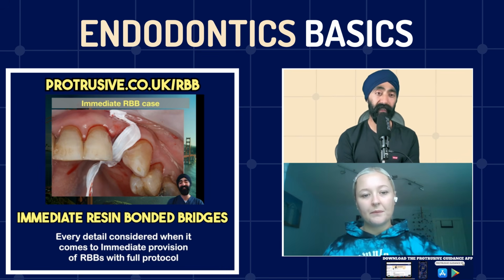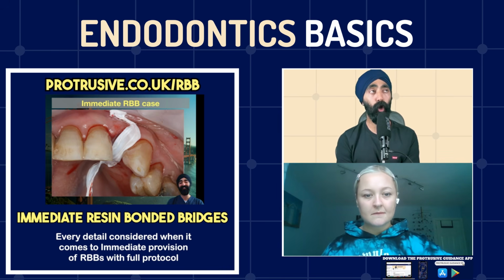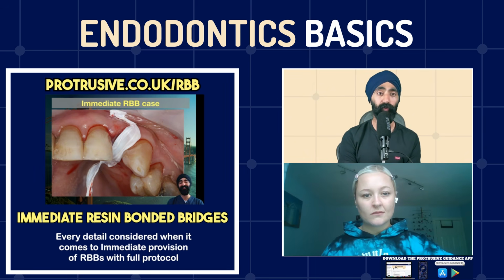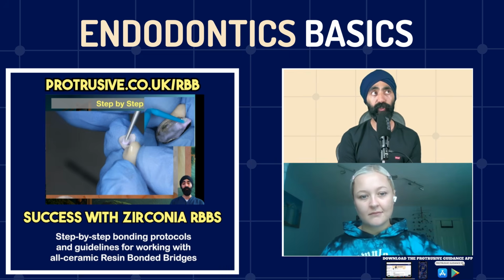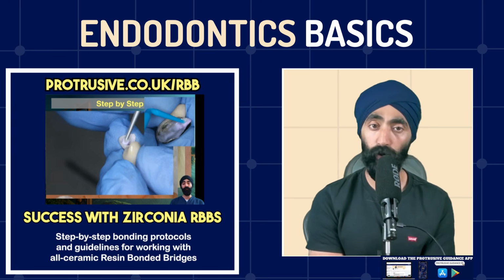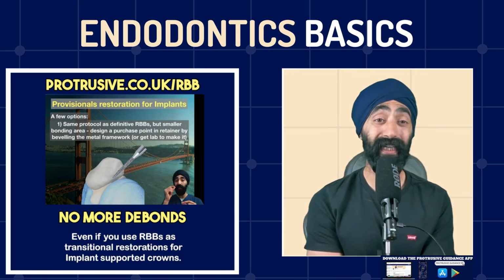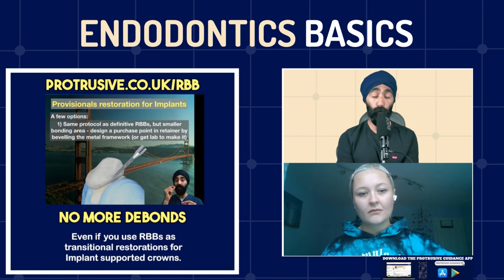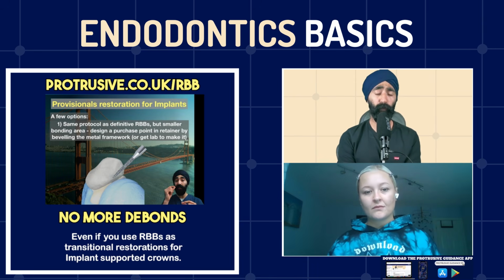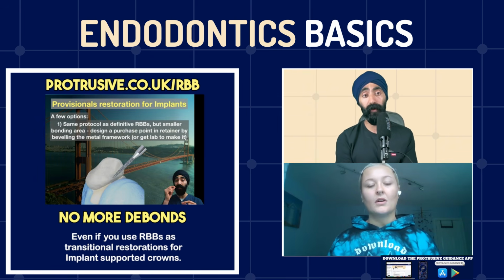And so at the very least, I like to do a pre-endodontic build-up. Back in the day, I did not appreciate this stage so much, and I used to drill through old amalgams to try and find the canals, and I'd leave the amalgam there. But actually what you need to do first is strip back the entire tooth, make it naked, remove everything. Then do caries removal, then put a matrix band on, and get your pre-endodontic seal or pre-endodontic restoration. There's a big block of composite, right? And then you do your endo through that. This is the gold standard that I've learned now.